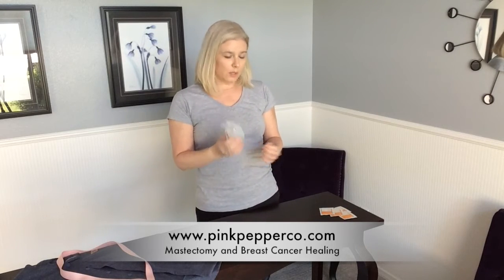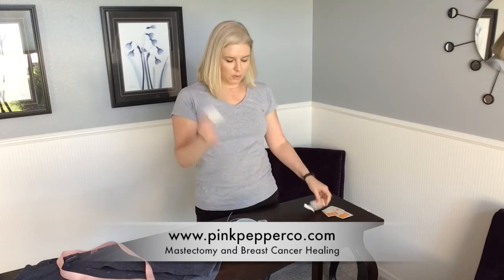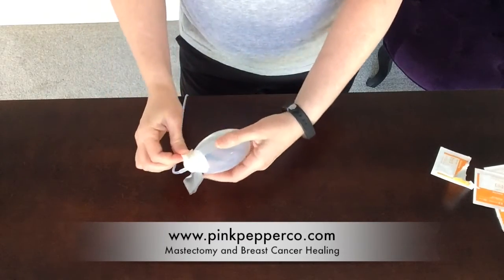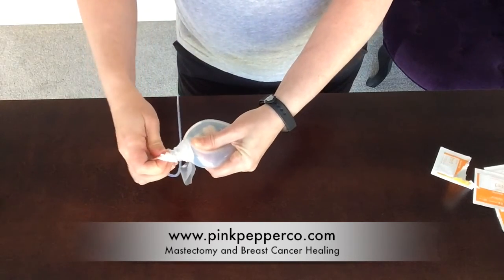One of the really important things about draining your tube is you're going to use these alcohol swabs. After you drain it, you're going to clean this whole area really, really well all the way around, and then I used the alcohol swab to seal it back up.